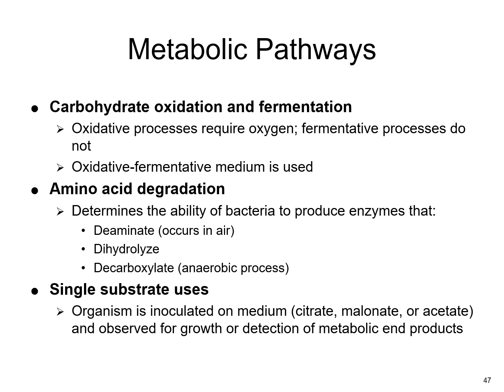You're also looking at amino acid degradation and how they're able to use some of these products with air or without air. And you're also looking at how they utilize certain types of media and how they grow on those media and the characteristics that they present with.